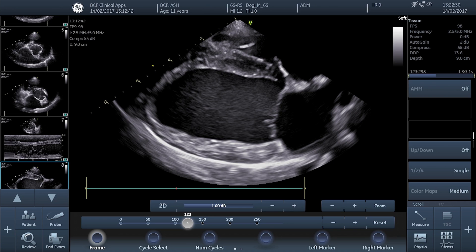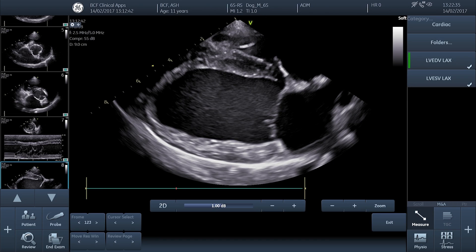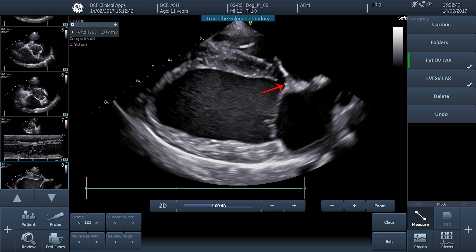We then need to select the appropriate measurement option from the measurements menu. Exactly how to do this will vary from machine to machine, so check your user manual or speak to somebody who knows if you're not sure. Once we've selected the correct measurement option, we're going to follow the on-screen prompts by placing the first cursor at the mitral annulus of the septal leaflet of the mitral valve — just here.